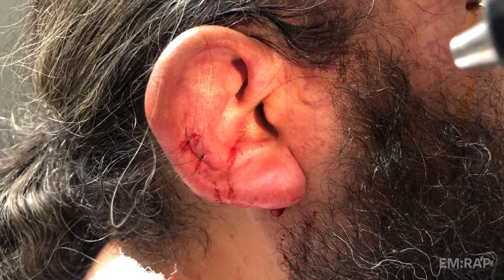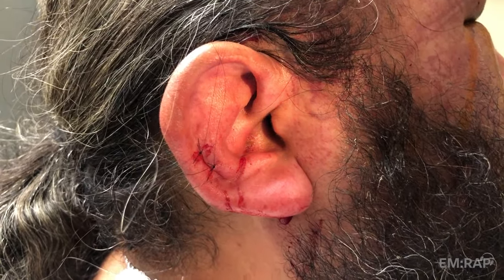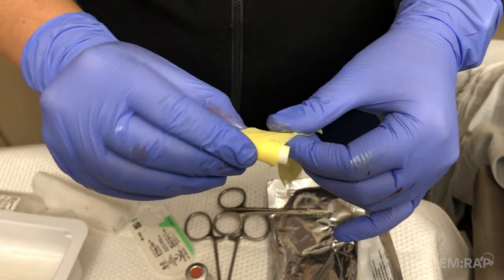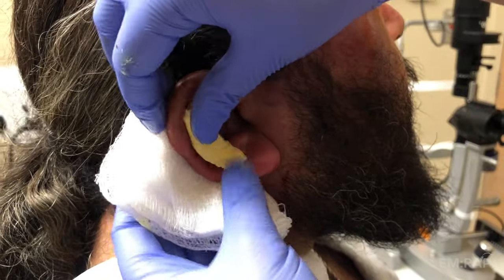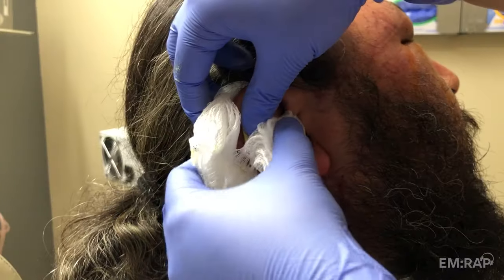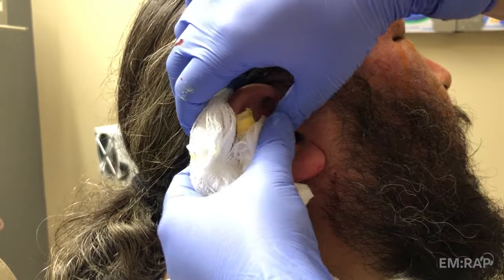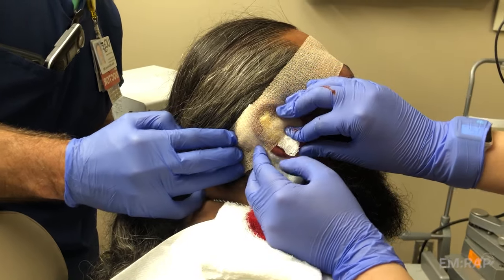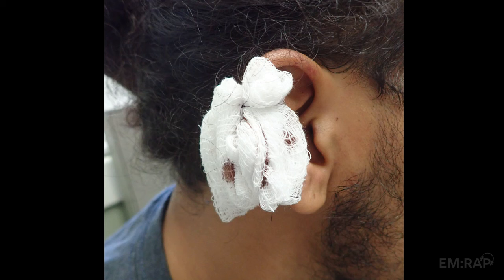The final step is the ear bolster. One way to do this is to take a dental roll wrapped in zero-form gauze, place it into the curvature of the ear between the helix and anti-helix, with some padding of fluff or 4x4s behind and on top of the ear, and then wrap a compression dressing over the top. Another way is to take a dental roll or some gauze and suture it through and through the entire pinna so it's cinched down on itself, preventing blood from reaccumulating.